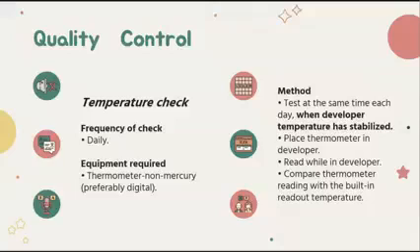Okay. Also, we have the temperature check. Frequency of check, dapat daily yan siya, once a day. Or if makaya, every now and then. Equipment requires thermometer, non-mercury, preferably digital. So the method is test at the same time each day when developer temperature has stabilized.